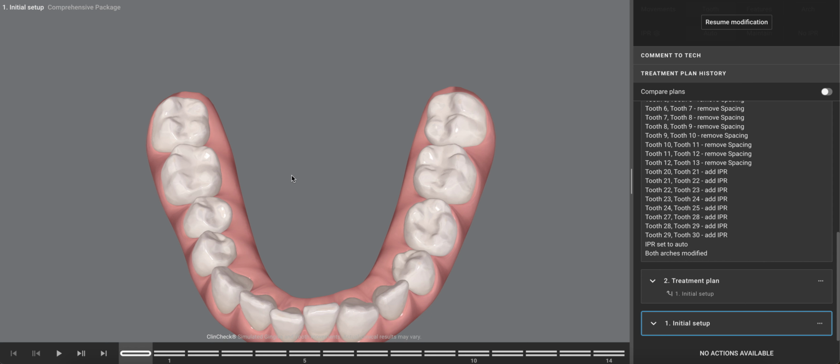The other thing is I'm often looking at, especially in crossbite situations, I'm asking the question, do I need to try to create mutually protected occlusion? And if that term doesn't immediately put a picture in your mind, I invite you to understand that concept to its fullest degree. We have a couple of occlusal videos on the Nikkei channel that talk about it.